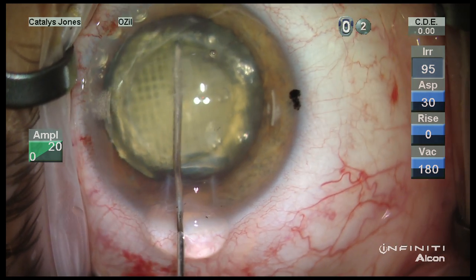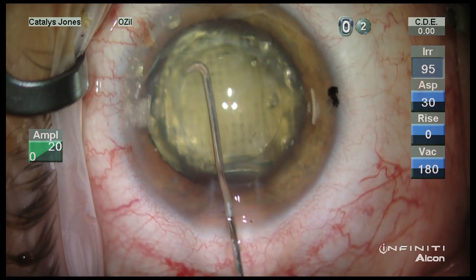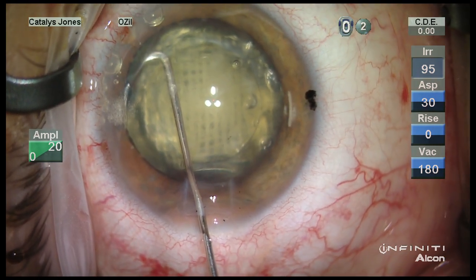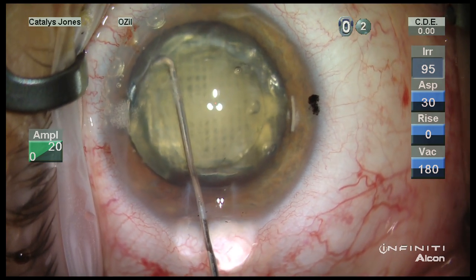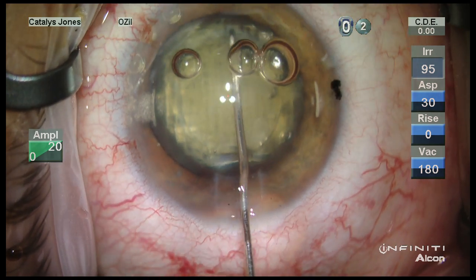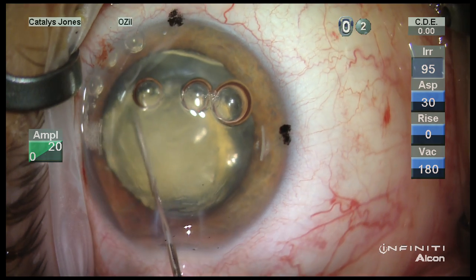Hydrodissection performed with a cannula is fairly routine with the exception of noting the interlenticular bubbles.